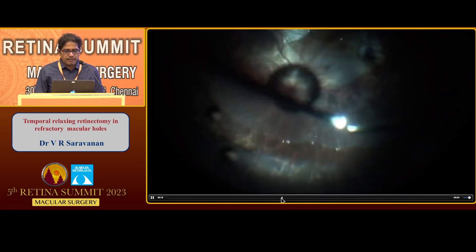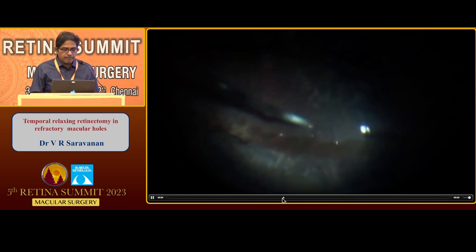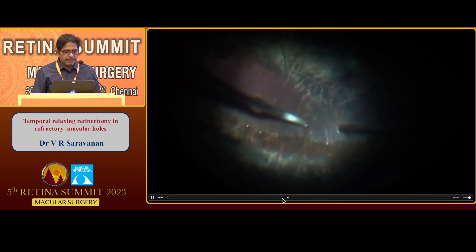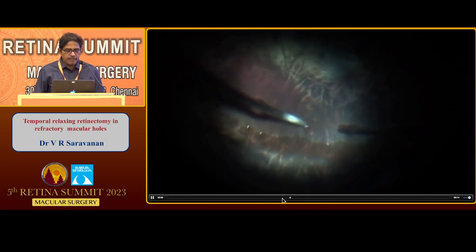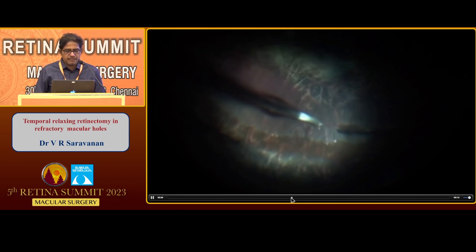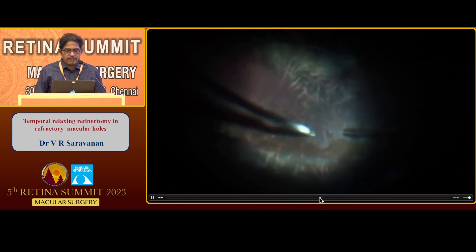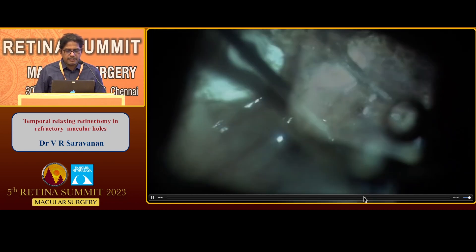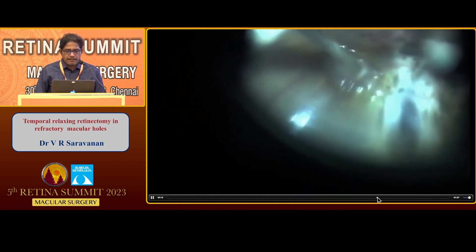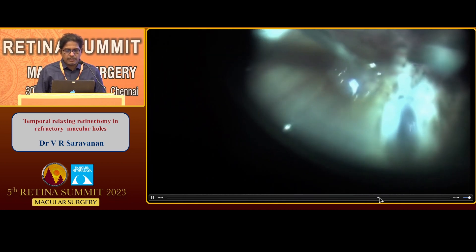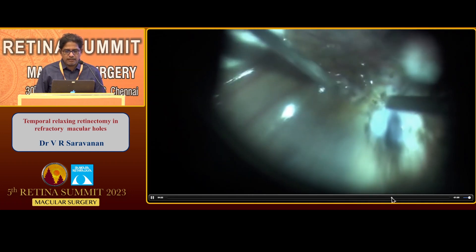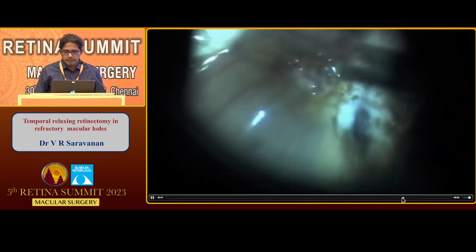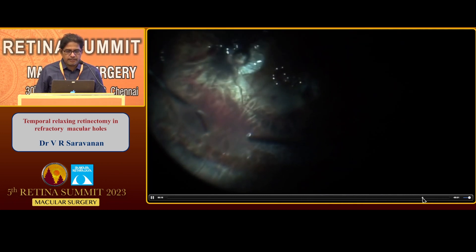So I went for a retinal autograft. I harvested the retina from the inferior relaxing retinectomy edge using vertical scissors. I harvested a small piece of retina and, under PFCL, dragged and placed it on the macular hole, just trying to insert the edges under the edge of the macular hole. I also did a temporal retinectomy to allow the retina to intentionally slip so that this will help conform the retina to the large staphyloma zone.